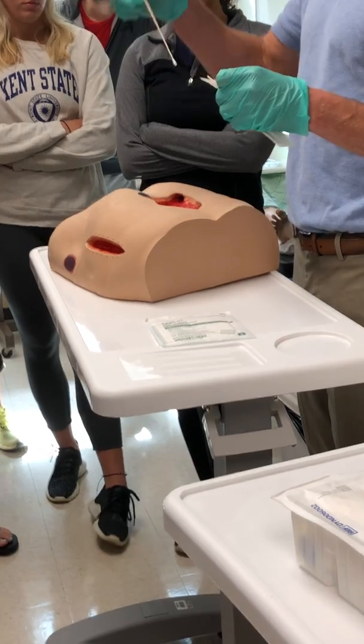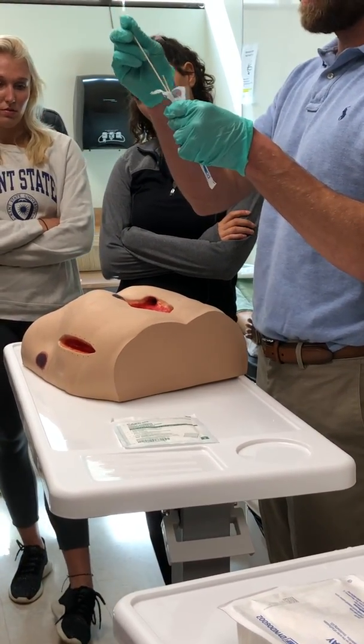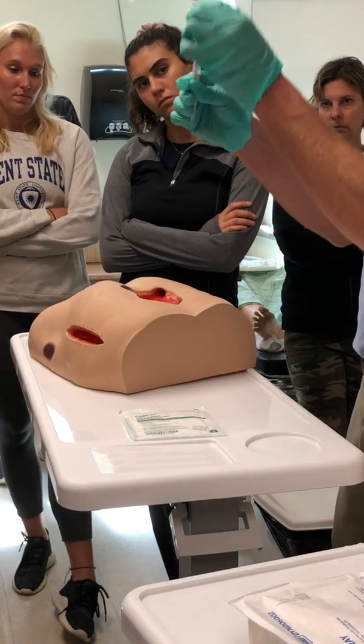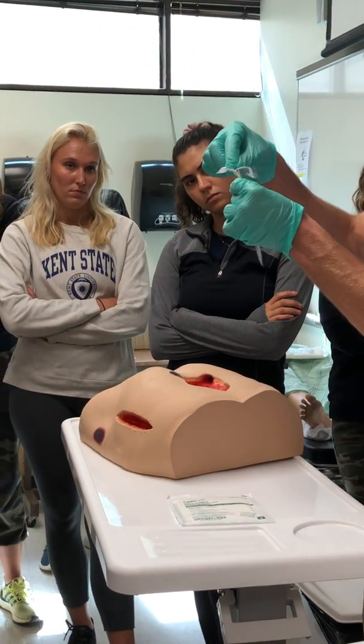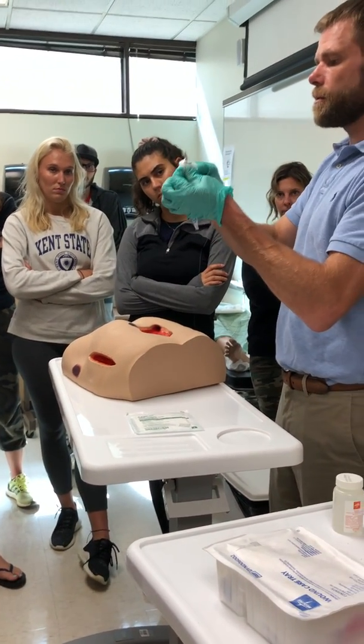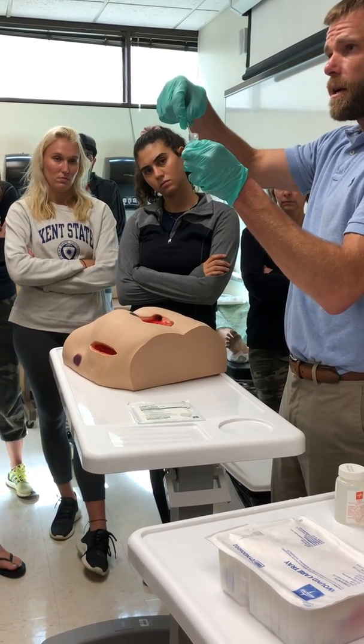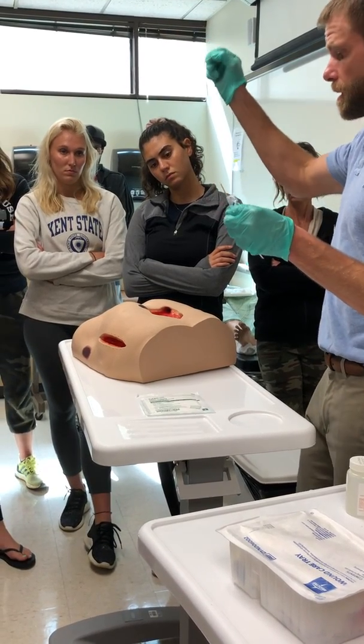So I'm going to grab... Guys, I always peel back and I hold it peeled back. What's the problem? You have nurses that open it up, come in here, and slide this out. That could touch what my fingers just touched. If I want to maintain the sterility, I've got to peel it back and hold it back, because I didn't touch right there. And as I slide that out, it's protected. Does that make sense to you guys?